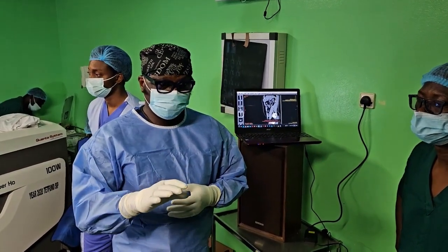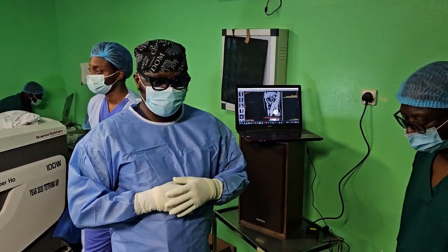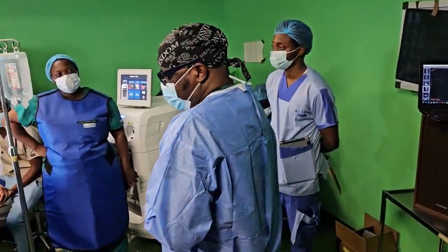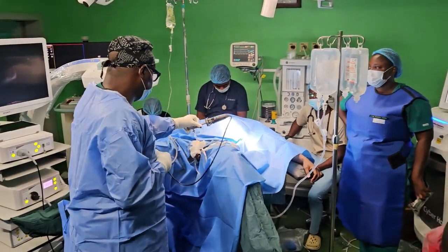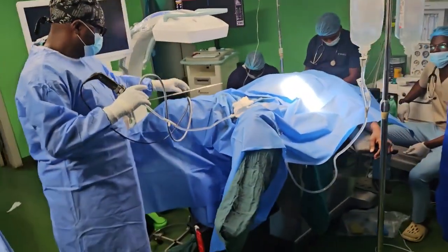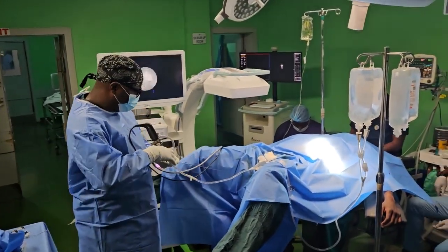Excellent. In the prone position, if you are doing prone, then it's supine if you are doing supine. So RPG gives very good information for all of us. Yes, so that you don't fix your mind on a particular pole just from seeing the images alone. Yes, but the RPG eventually will guide you on the best position. So we're going to remove the stent now.